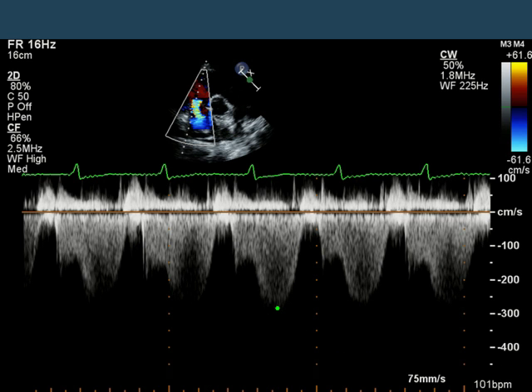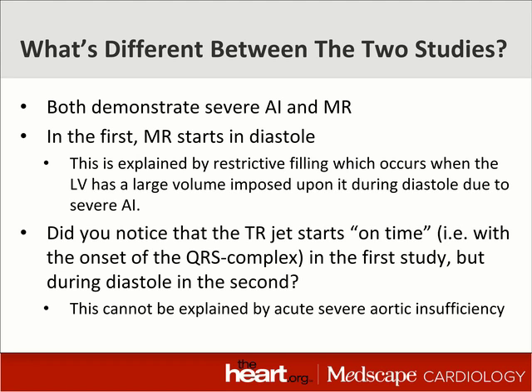But look what happened with the tricuspid regurgitation in the same patient. The velocity is almost the same — the TR velocity is measured at about 2.8 meters per second. But what's different is that the tricuspid regurgitation is now starting in the middle of diastole. It didn't do that before, but it is now. Why is that happening? The initial study demonstrated diastolic mitral regurgitation because of the restrictive filling imposed by severe acute aortic regurgitation. But what about the diastolic tricuspid regurgitation? Certainly the patient didn't develop severe pulmonic insufficiency, and we can't say there was something parallel happening on the right side of the heart to account for that.